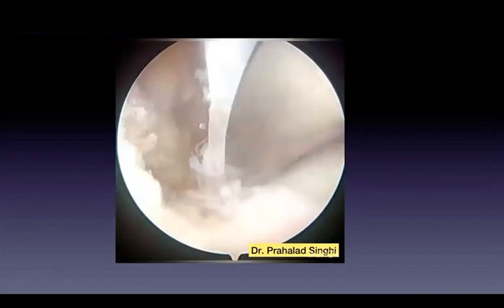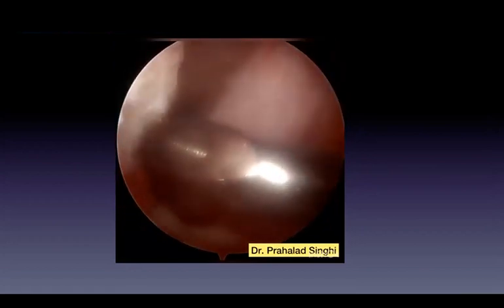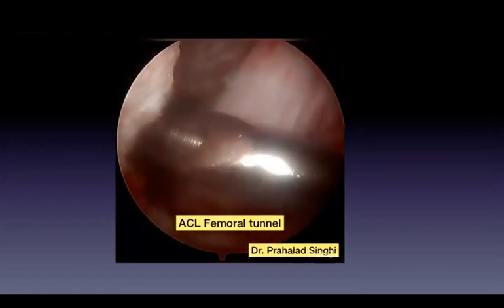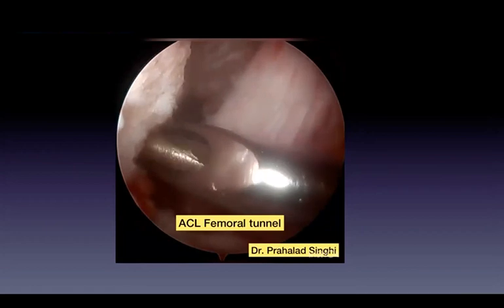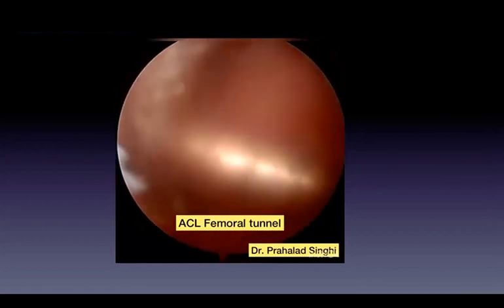Since the knee was very open, we were able to manage with only a single posteromedial portal, and this is the ACL femoral tunnel, which is done by inside out technique as a standard ACL tunnel.